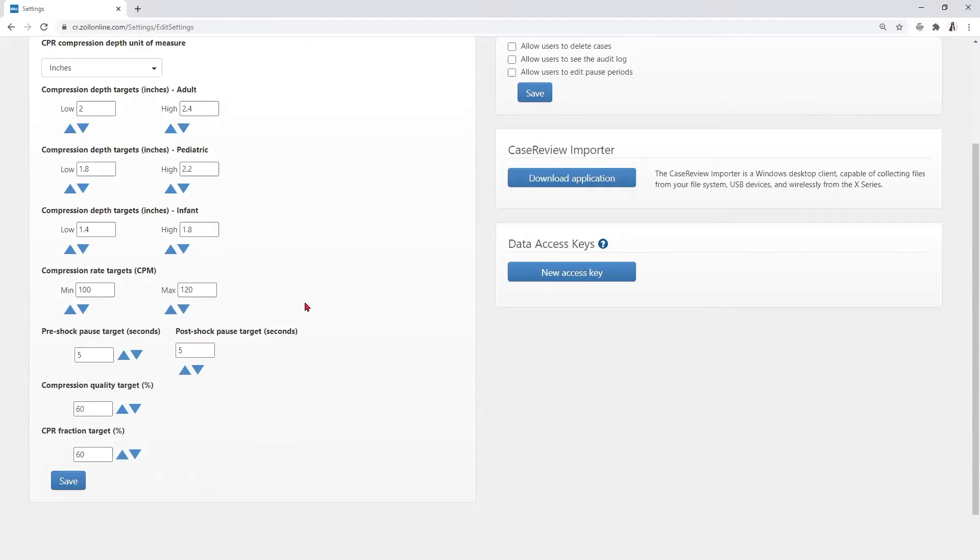Once all CPR settings have been adjusted, the user can save them by selecting the blue save button.